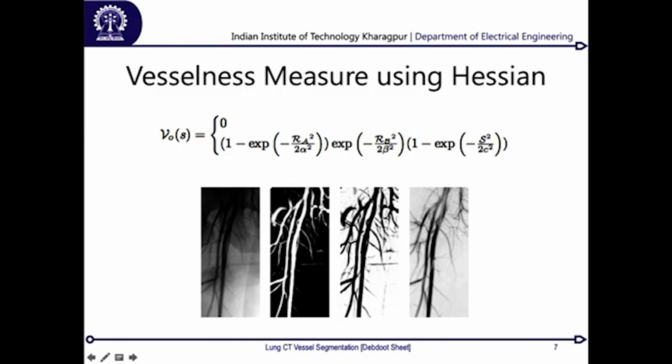Now using these two factors, you can obviously correct for the intensity inhomogeneity over here, and then you get this sort of an image. What it would do is essentially subtract out everything in the background other than the vessels kept in their raw intensity, and now what I get is an angiogram image, or a map of all the vessels in its original form, without the inhomogeneity in the background intensity at all.